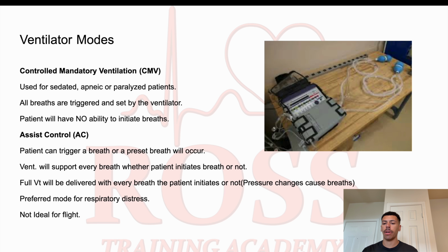So now let's go ahead and talk about our ventilator modes. The first mode is going to be CMV, and typically CMV is not going to be used, especially not pre-hospitally or just outside of the hospital in general. And that's just because the patient needs to be heavily sedated, apneic, and or paralyzed for CMV to be comfortable for them, because all of the breaths are going to be triggered and set by the ventilator. So whatever numbers, frequency, tidal volume, everything that you set in that ventilator is what's going to be given to that patient, and they're not going to be able to breathe outside of what you have set. And so again, the patient will not have any ability to initiate breaths.